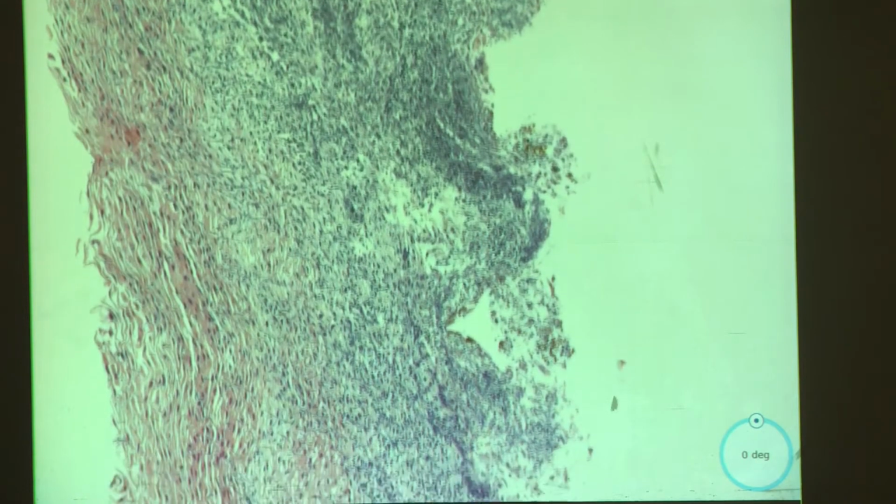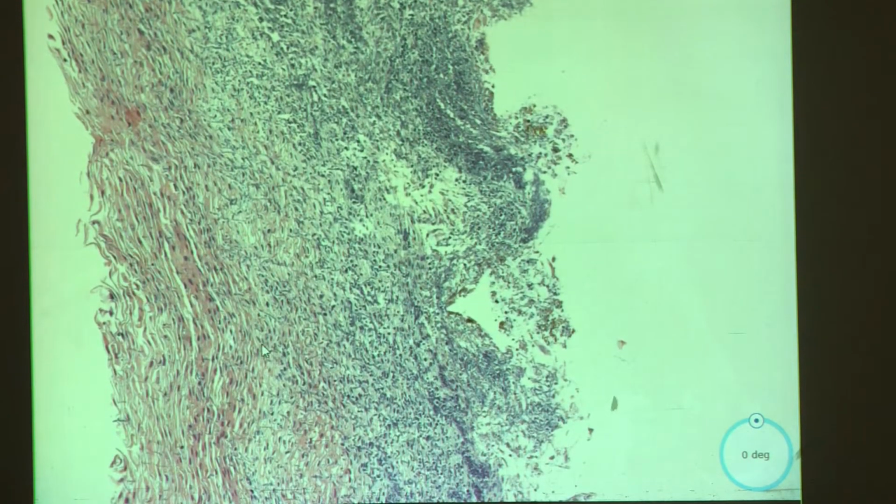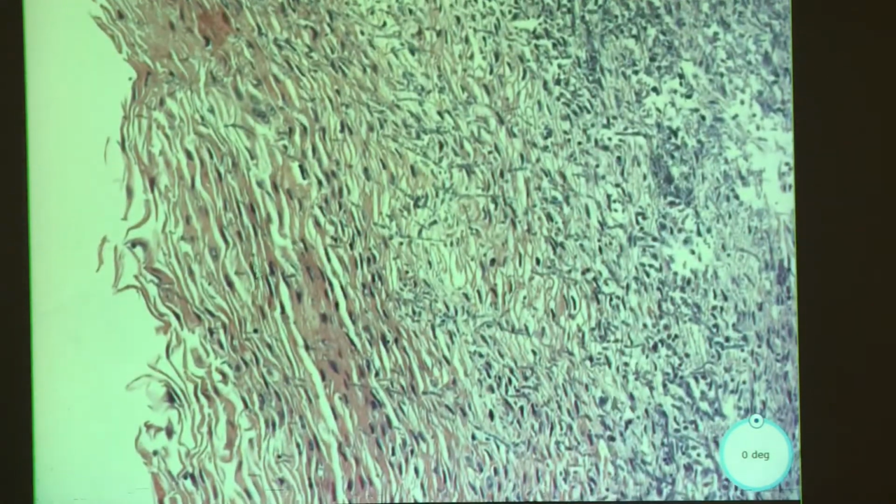Okay. There's the muscle there, I think. Or is that a really wrapped up squamous? There you go. It's probably wrapped up squamous. Never mind. Spongiotic, maybe? Yeah, it's not happy. It's not happy. It's okay, yeah.